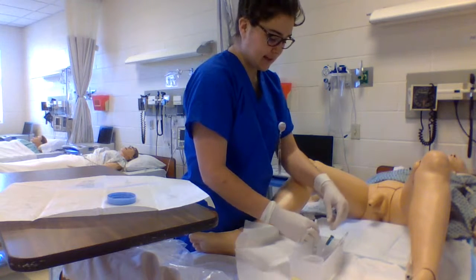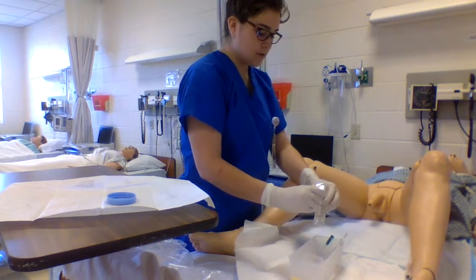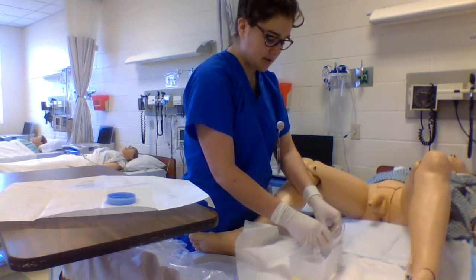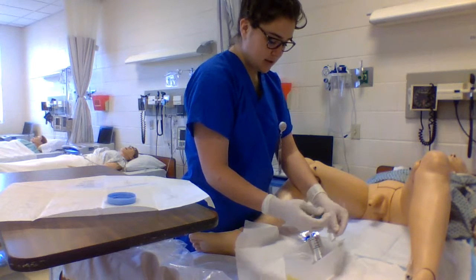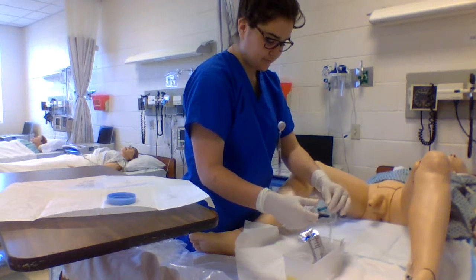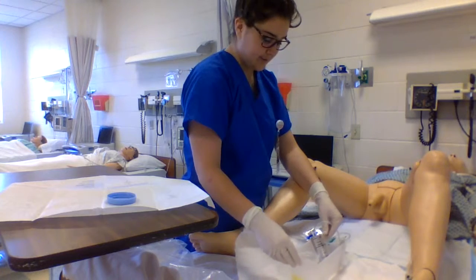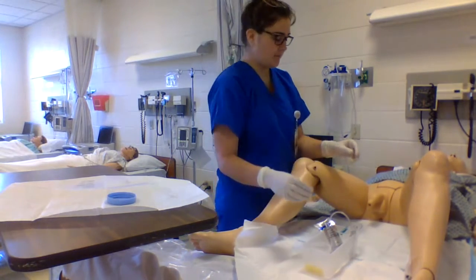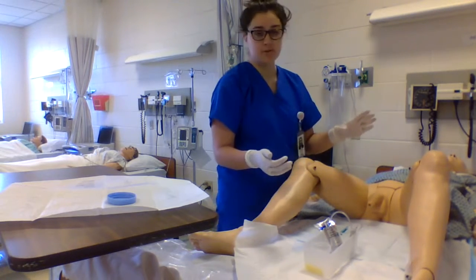And I'm going to go ahead and get my swabs. I'm going to open them and kind of shimmy them out a little bit so I can easily access them with just one hand. So I'm going to go ahead and get my catheter set up in the right position. Alrighty. So now that I've got that, I'm going to place my kit fairly close to him. So now that I've got all that set up, I can use my dirty hand.